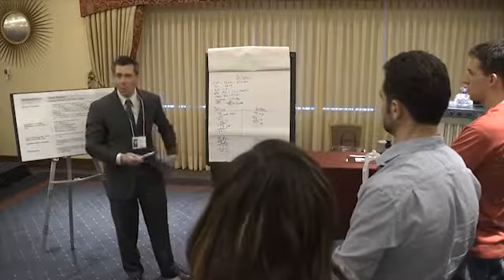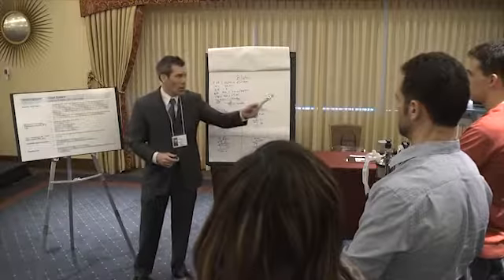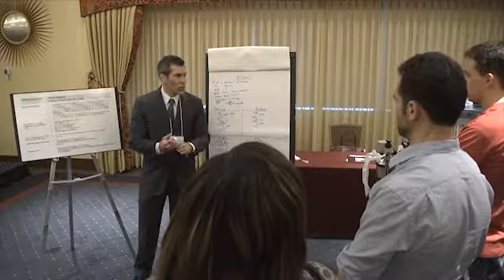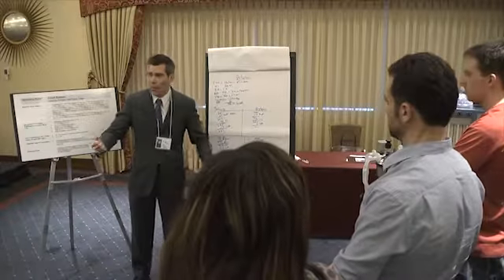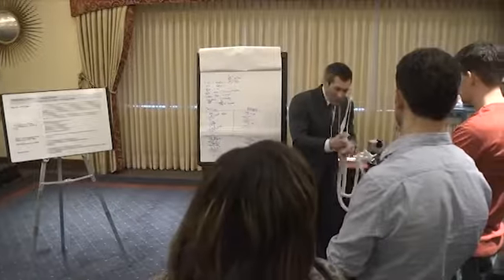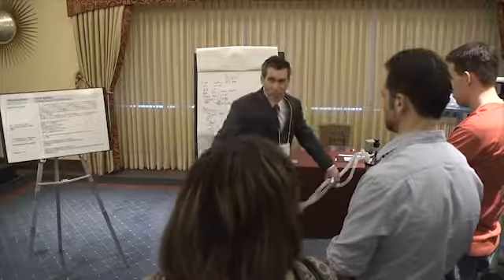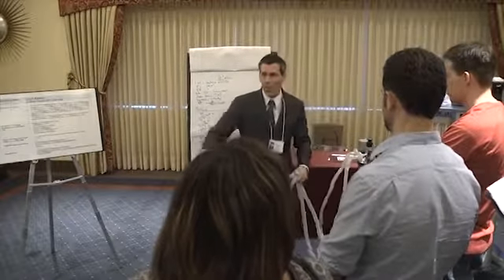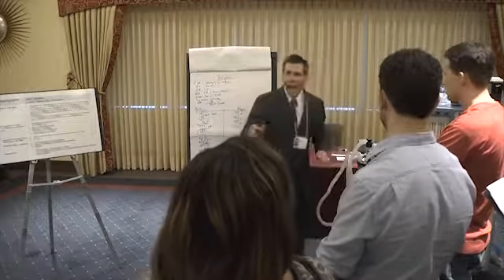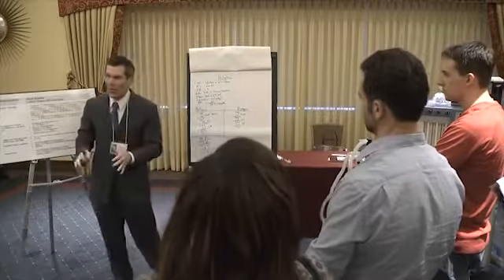I think some of the things to note in all the variables here are that when it comes to compliance compensation, when you do the machine leak test, you want to make sure that your tubing is stretched out to the farthest point possible, because these are collapsible circuits, and if you leave it the way they come in the package, all constricted, it's going to have less compliance than if you stretch it out to the distance you're going to. So it's nice to know what kind of case and where the patient's going to be in that case. Stretch out the circuit, and the reason you do that is not for the everyday case. You do that for when that patient starts decompensating.